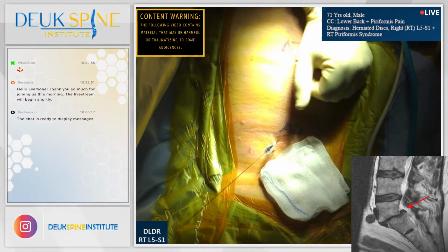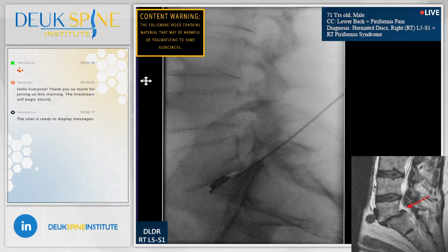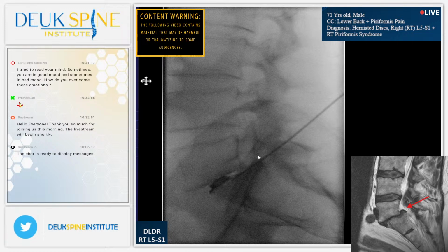He does have a crack and a fracture through the pars, which is very common. You can see that on the x-ray. Jordan, show us the pars defect. It's called a defect. A little bit lower, or to the right, a little bit, no, up, right there. See that? Stop, right there. That is the crack, and that whole piece of bone right there should be lined up with the bone where the arrow is. It should be lined up on there. So it's clearly slipped forward. We call that a pars defect and a spondylolisthesis.